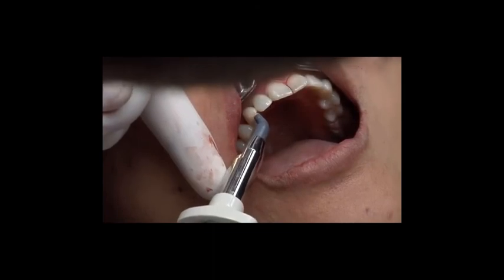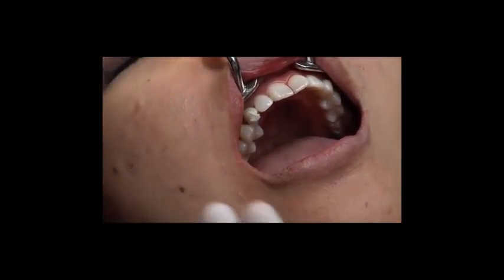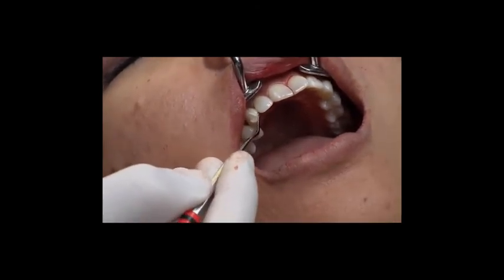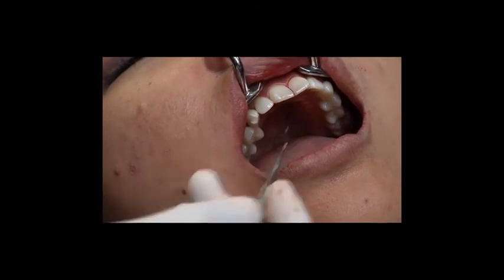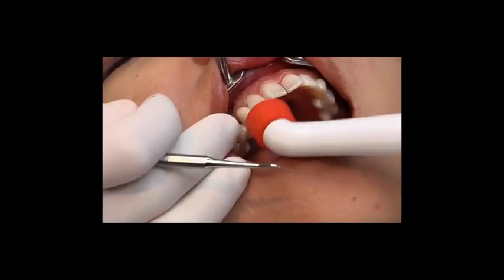In this case, it was right through the incisal edge, so the composite had to be done. Otherwise, the Teleo restoration that is real nice, because that can then just be placed very quickly. It's light cured, but then later on it doesn't have to be drilled out. It can just be plucked out.